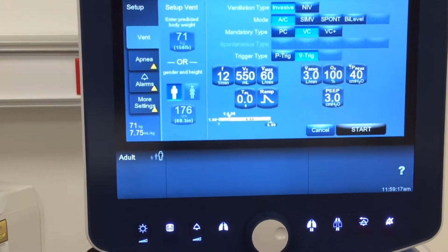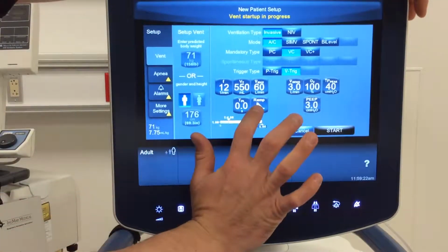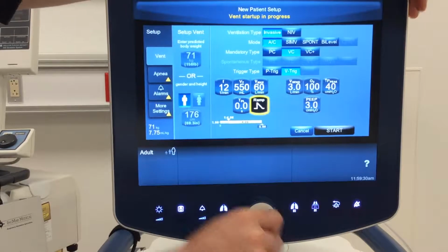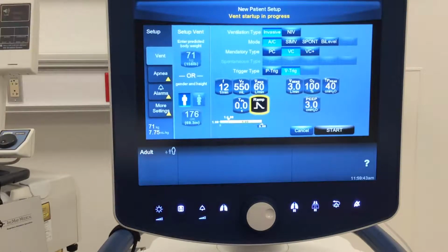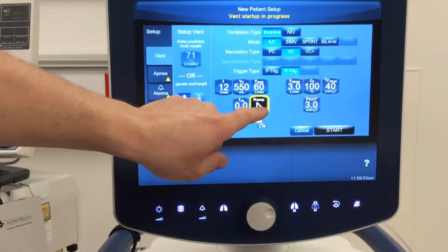And I'm going to zoom back out just a little bit here. There we go. So this goes by a bunch of different words: ramp, decelerating flow waveform, exponential decay, but essentially it's dictating how we are going to deliver that flow to the patient. Older ventilators, you didn't have the ability to do this in volume ventilation. Modern ones we do. And what we typically find us using on a majority of our patients in volume ventilation is this ramp or descending, decelerating flow pattern. And what that means is you are delivering 60, but just like when you think about breathing, when's your flow the highest?